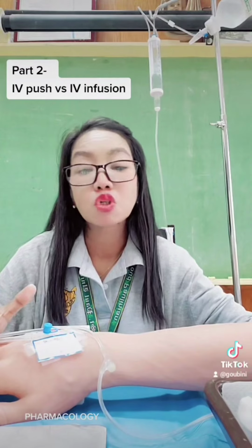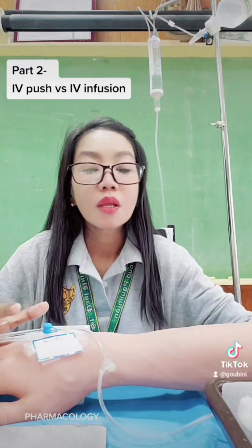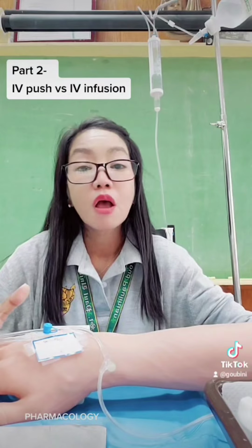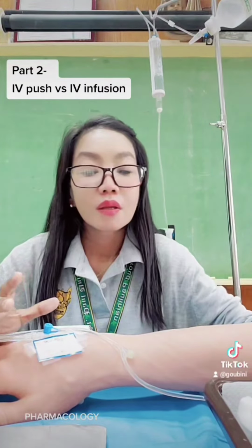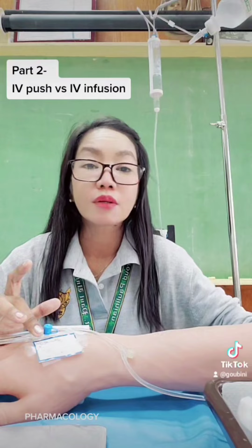We refer to this as a drip infusion method, which uses gravity to deliver a constant amount of medication with a drip. The medication and solution drip from a bag or bottle of NSS such as this one, then through a tube into your catheter.